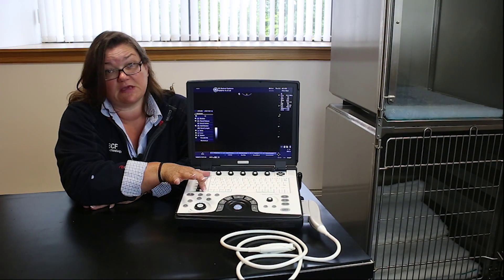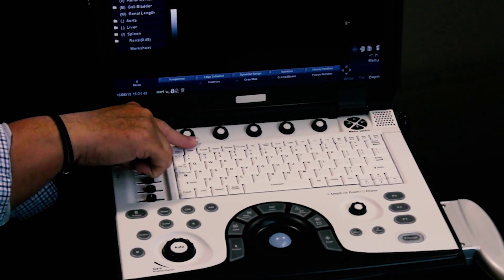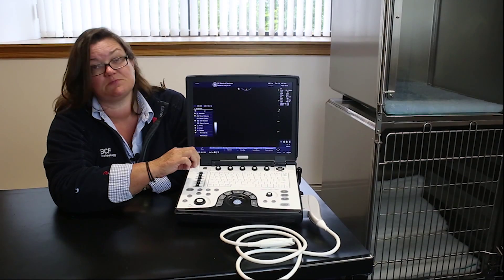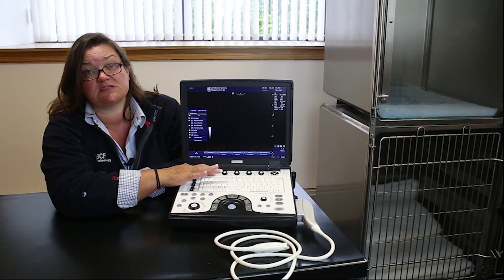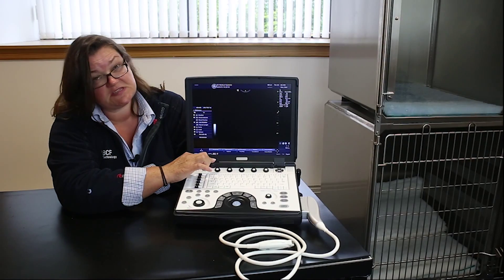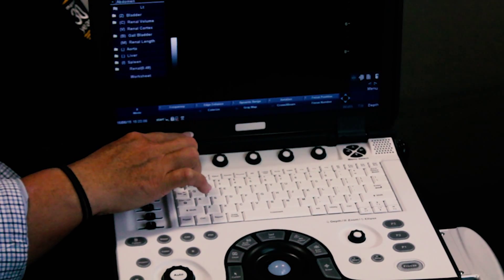There's a full alphanumeric keyboard, and then these five rotary knobs at the top correspond to different menu functions depending on what mode the machine is in. There are sub-menu functions that you can access by pressing the central white knob. You'll be able to see what they refer to by looking at the area of the screen above each button.